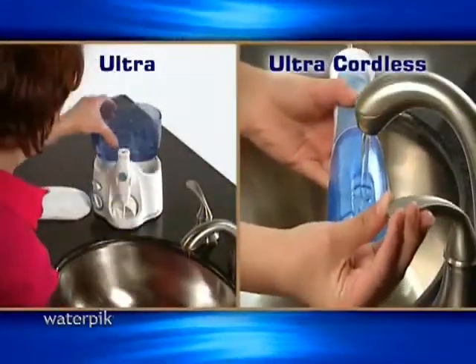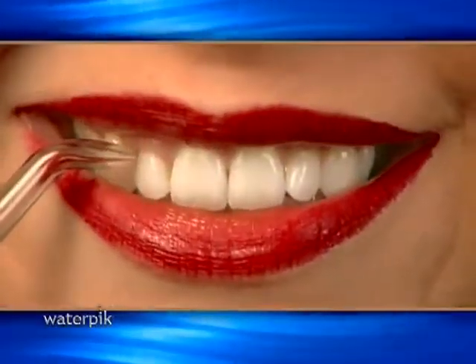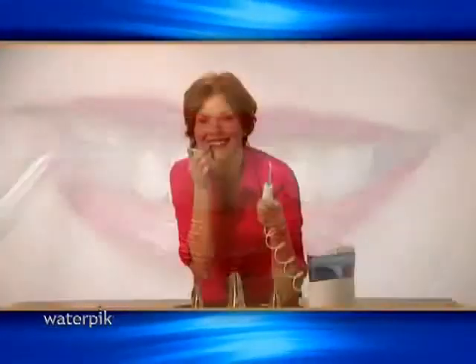Just fill, hold the jet tip at a 90 degree angle to the gum line and turn on the unit. In minutes you will be on your way to a healthier smile.